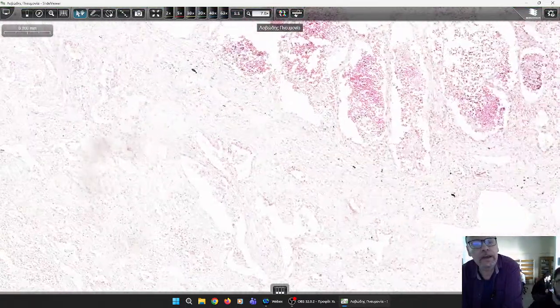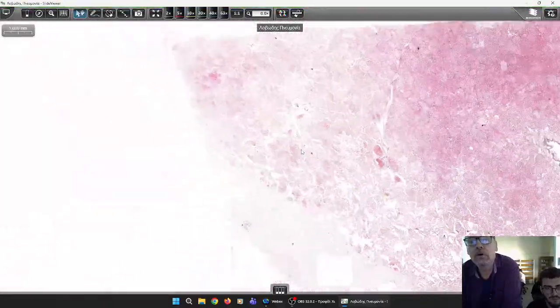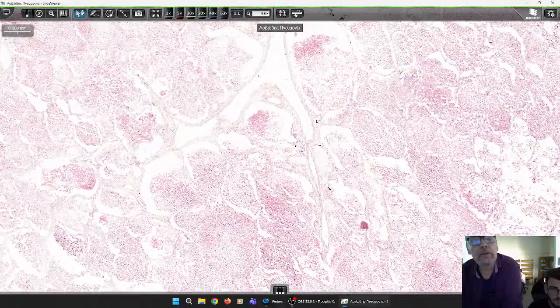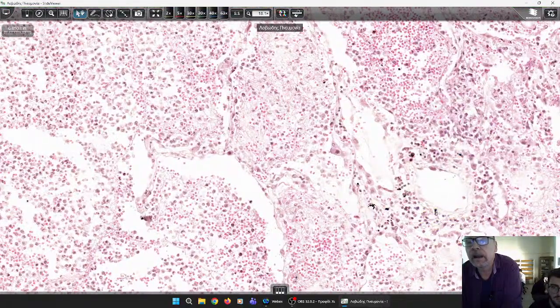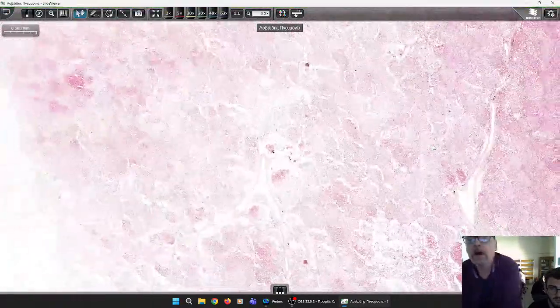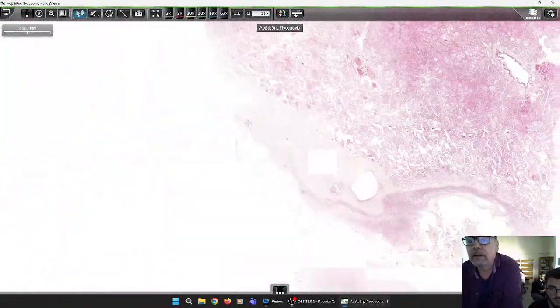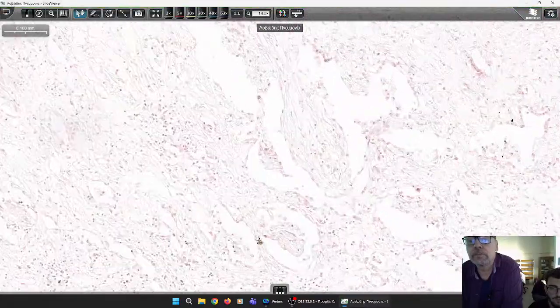That's why their shapes are abnormal. You see, here these ones are full of exudate, but you can see that the size is relatively retained. Here are the septa. Here is the airspace filled with exudate, of course. However, in the other area, they are deformed. You see?